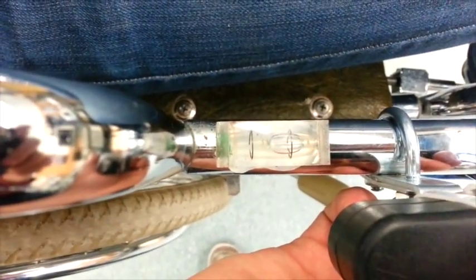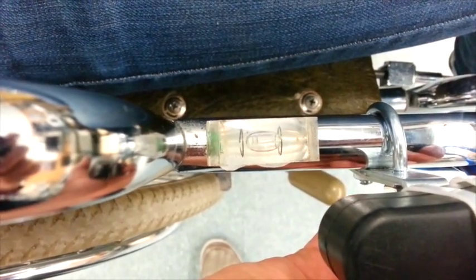A level is located near the right armrest to ensure proper balance of the wheelchair when ascending or descending.